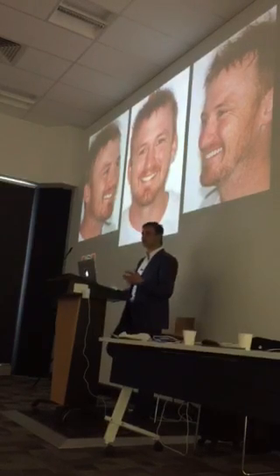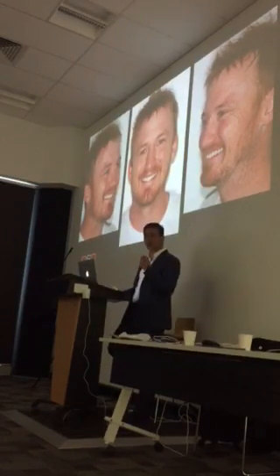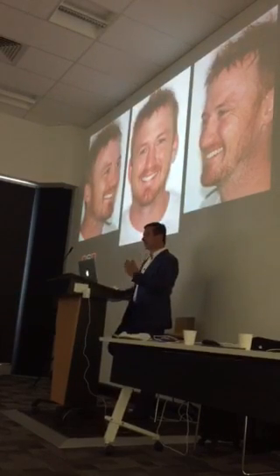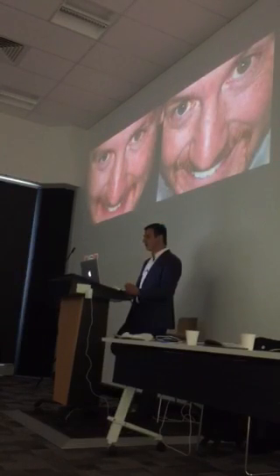You always show the patient, and we'll go through this, the photos, where you don't give them a mirror for these mock-ups. You want to have a look at it in terms of the face, look at the lines, compare it to both photos.